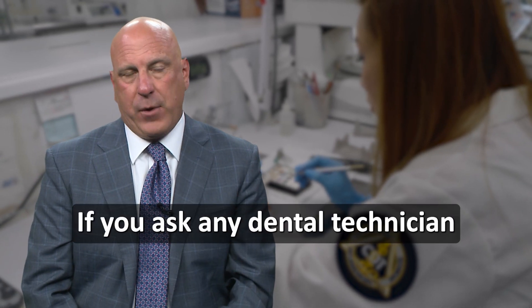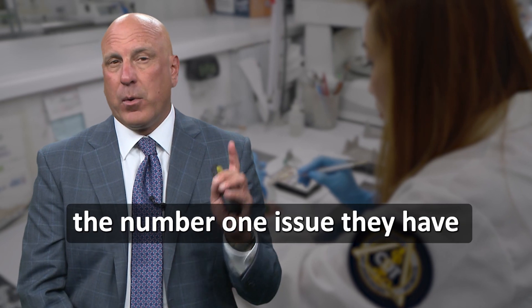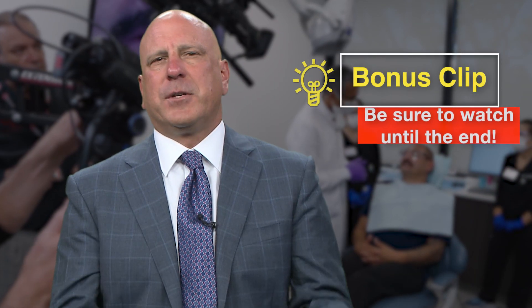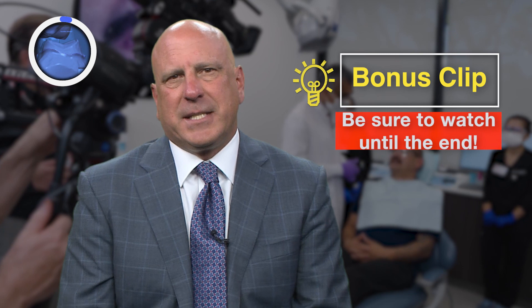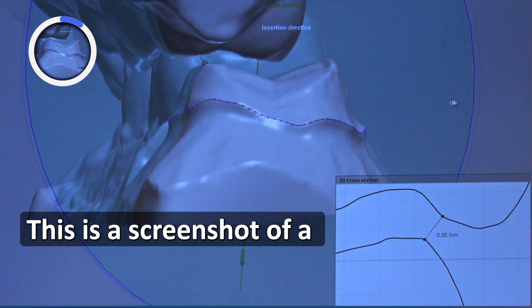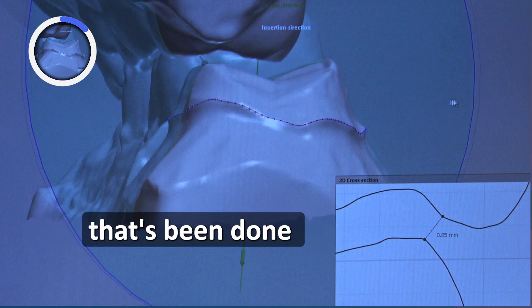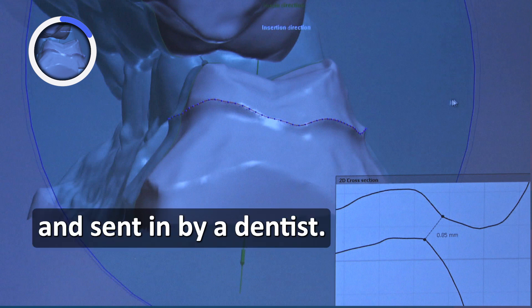If you ask any dental technician or any laboratory owner, the number one issue they have with dentists is definitely under-reduction. We've had 30 years of a pretty good thing in dentistry, and it's time we have to step up to the plate and do our job. This picture on the screen illustrates this — it's a screenshot of a dental technician at the laboratory measuring the reduction done for an Emax crown on a molar sent in by a dentist.